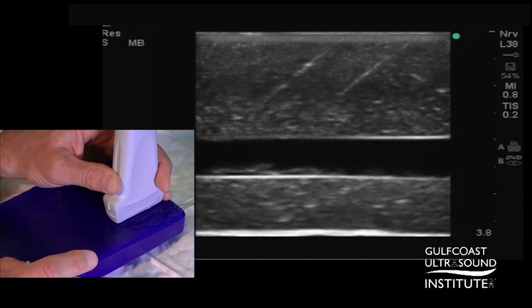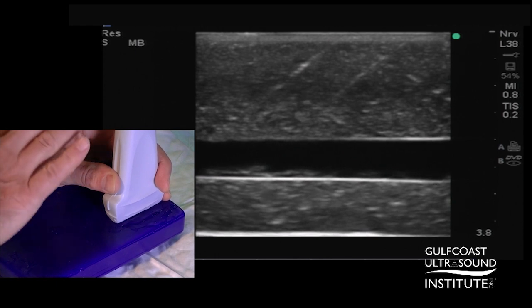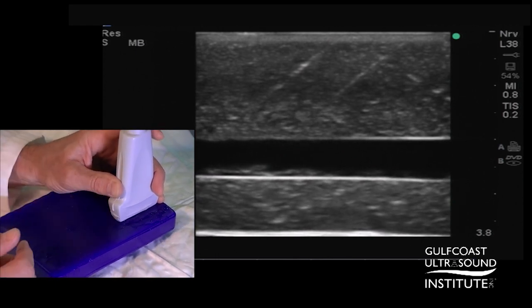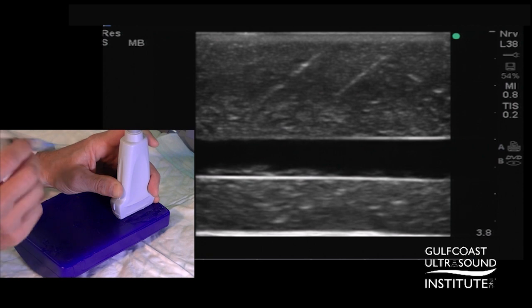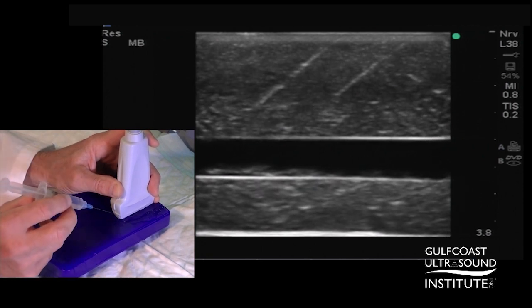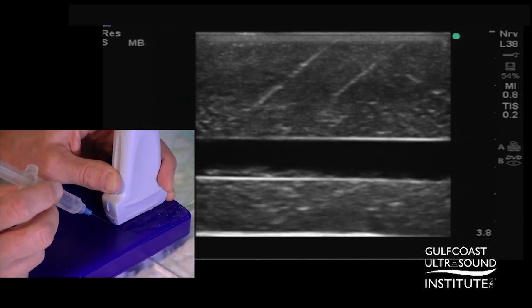Once you have a good view of your target structure, you want to keep your probe hand motionless. That means you need to have good stabilization of your arm, hand, and probe, because from now until you've entered the target, you do not want to move the probe at all. We're going to advance our needle at the very edge of the probe and at about a 45 degree angle.